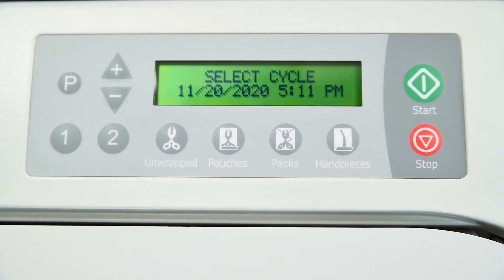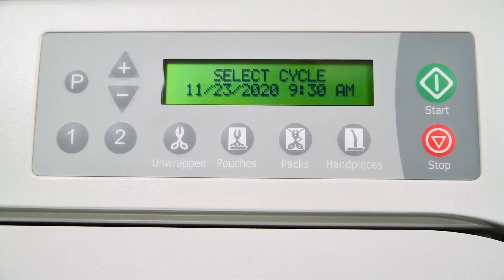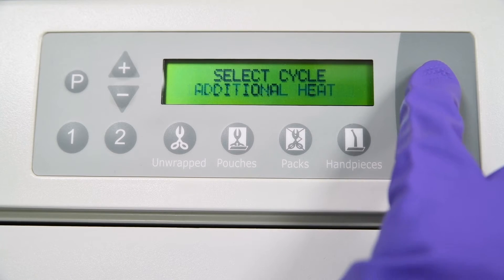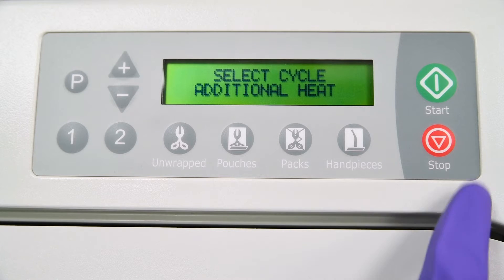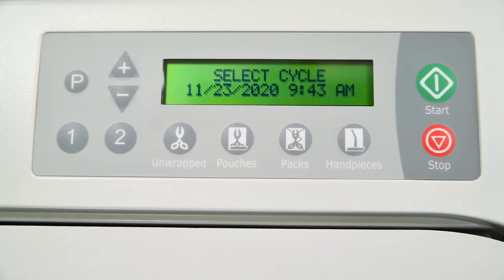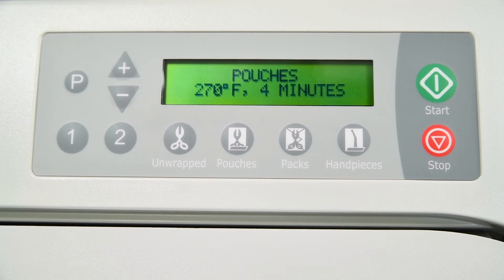The display will show select cycle and then waits for input from the operator. To begin the cycle selection process, push the start button. The additional heat message will appear, allowing the user to preheat the unit if desired. When preheating is complete or if no preheating is desired, press the stop button to end this phase of cycle selection. Based on the type of load to be sterilized, select the appropriate cycle key. Please refer to the user guide to determine which cycle is appropriate for the load that will be sterilized.